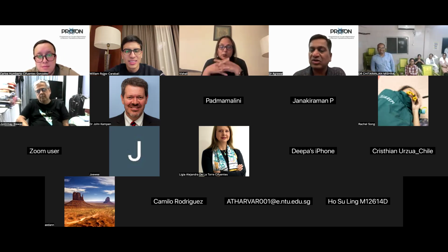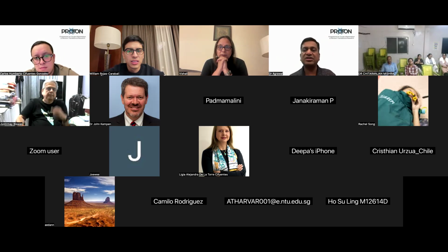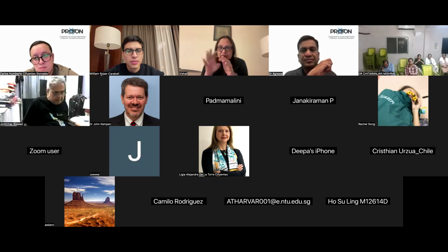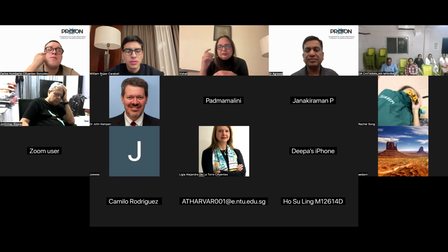Great. So, Dr. Vishali, there is one question from our research assistant, Dr. Deepa: what is the role of ultra-wide field imaging for children compared to adults with retinal disease? In children, I always do it because it's easier. With the conventional camera, moving here and there becomes very difficult. It doesn't have flash, so it's comfortable. Optos and all SLO systems won't have flash, but this is comfortable because in one go you can just take the picture, and in children I find it very useful.